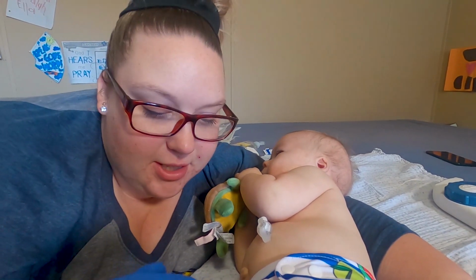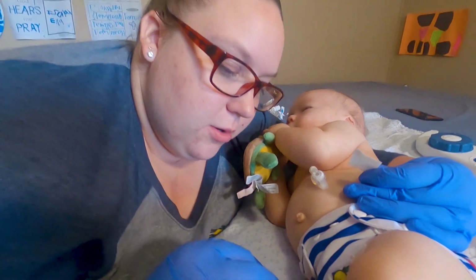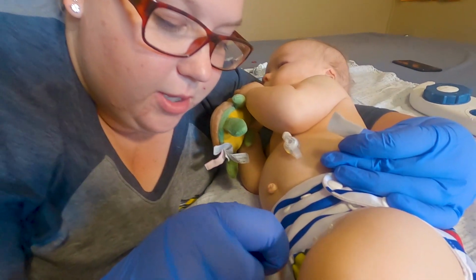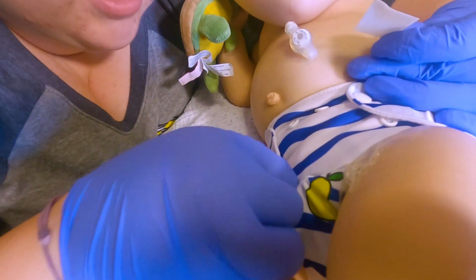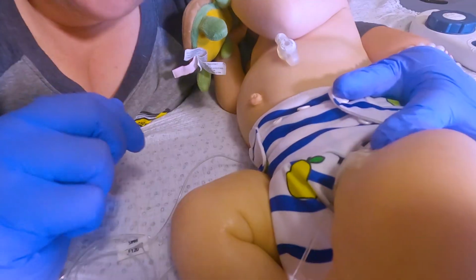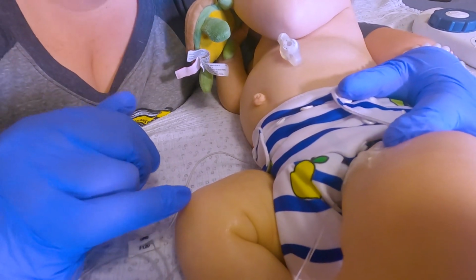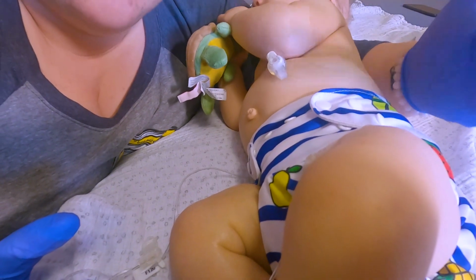Okay, so sometimes this is just kind of what happens. You end up having to hold him through the whole thing. So you do the same thing on the other side. I'm going to peel off the Tegaderm, which is not as terrible as he's making it. He's being a little dramatic about life today. Okay, you want to make sure his leg is really nice and dry, so that way the Tegaderm is going to stick.